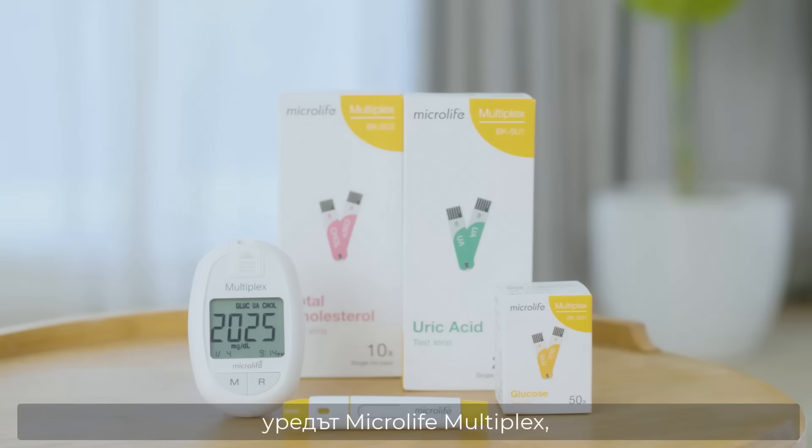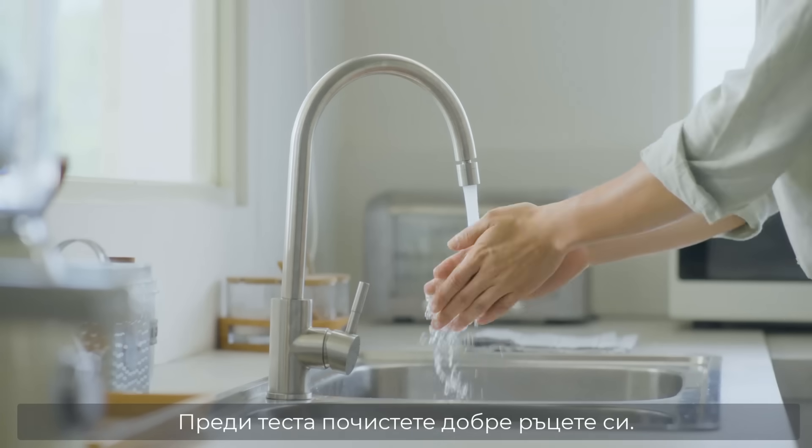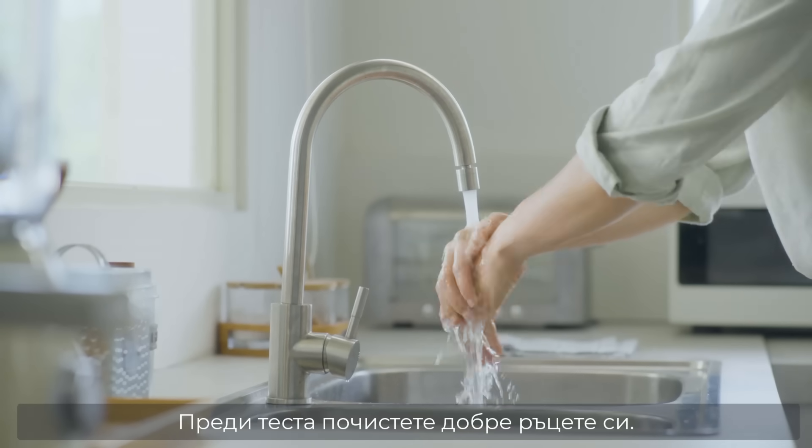To start, you need the MicroLife Multiplex meter, test strips, a lancing device and a lancet. Wash and dry your hands thoroughly before use.